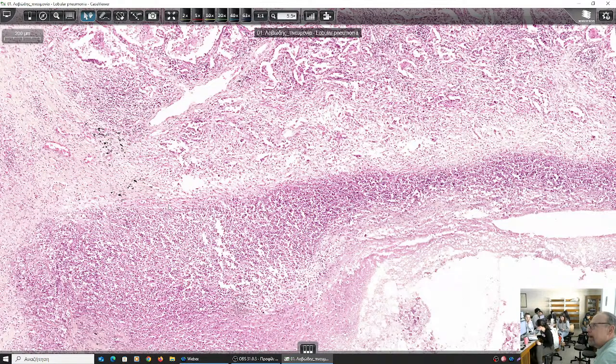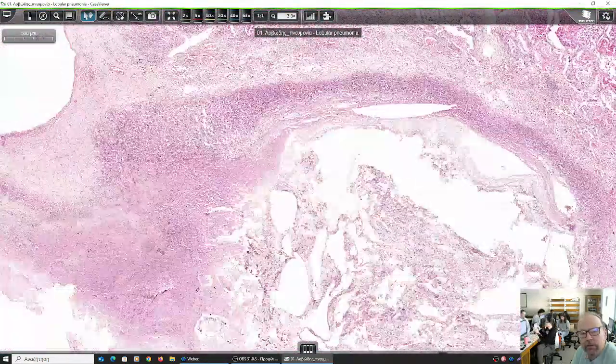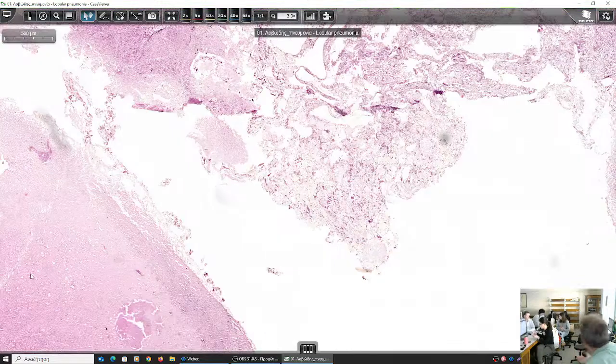That's right. Try the mouse, it's easier. Here, for example, is a vessel. Okay, you get +5. You see? That's where the drug comes. Where are the microbes? Down here. So the drug cannot reach the microbes and destroy them.